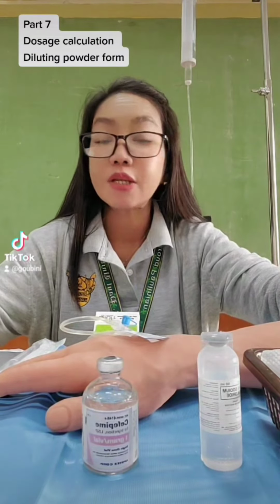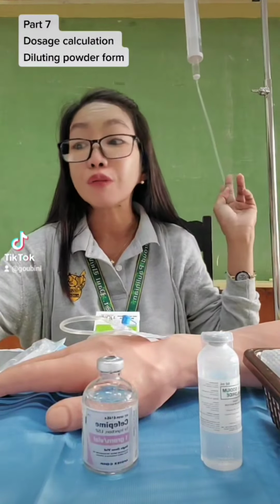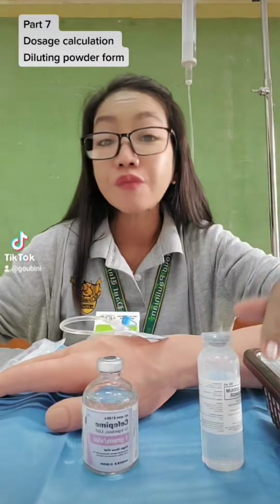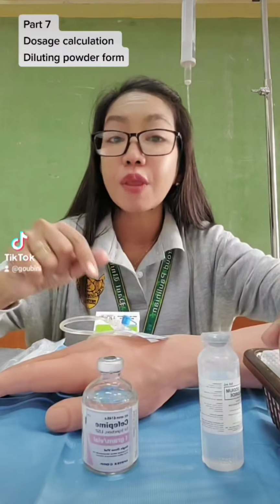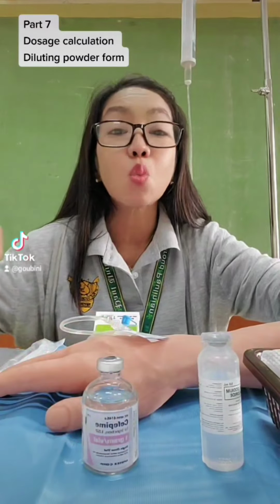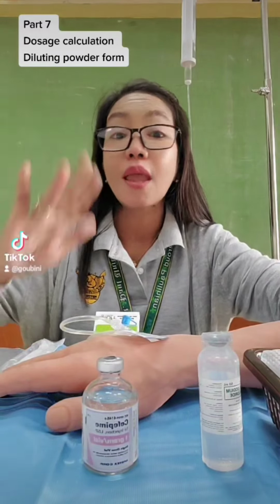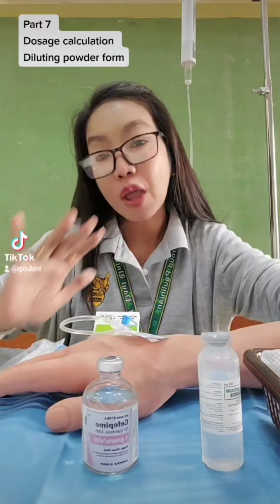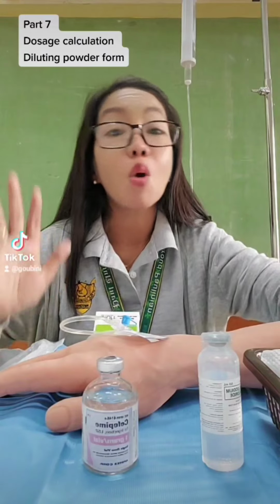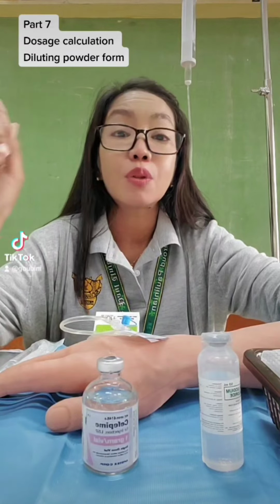Let us now prepare the medication. You will need to calculate the dose of the medication and then the rate of your drip infusion. Your desired dose is what is ordered by the doctor: you give 500 milligram of your Cefepime, and your stock is 1 gram Cefepime. 1 gram is 1,000 milligram, so that they have the same unit. So 500 milligram divided by 1,000 milligram times 10 cc. According to your drug study, you will dilute the powdered form in liquid form.